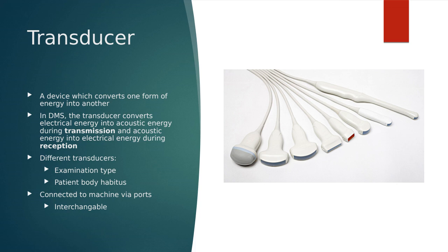When we're first starting out, one of the most important things, depending on the exam that we're scanning, is going to be the type of transducer that we're using. The transducer itself is responsible for converting one type of energy into another. In clinical ultrasound, the transducer converts electrical energy into acoustic energy. We send electrical energy into the transducer during transmission, and then we receive acoustic energy during reception.